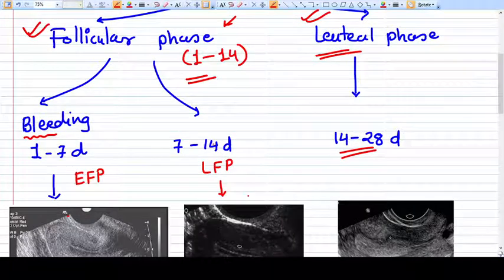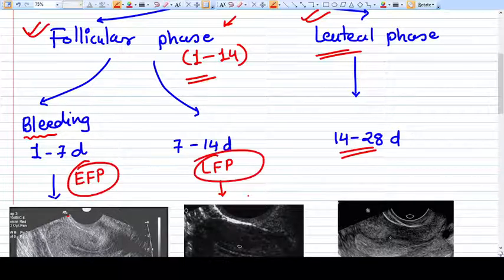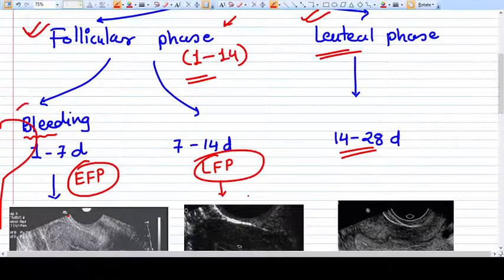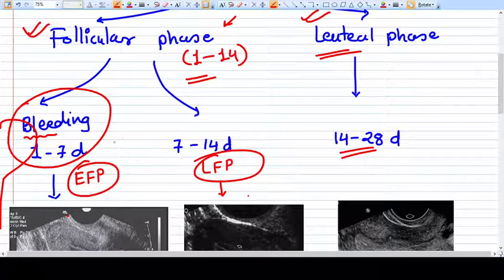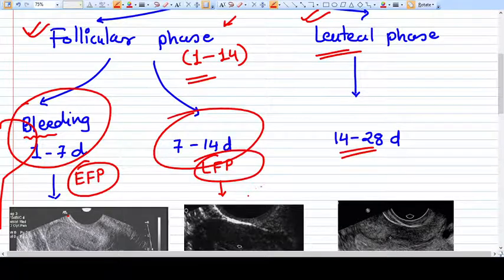The follicular phase is again divided into early follicular phase and late follicular phase. In the early follicular phase, days 1 to 7 generally correspond to menstruation — the periods or bleeding. From day 7 to day 14, in the late follicular phase, the endometrium starts generating again.